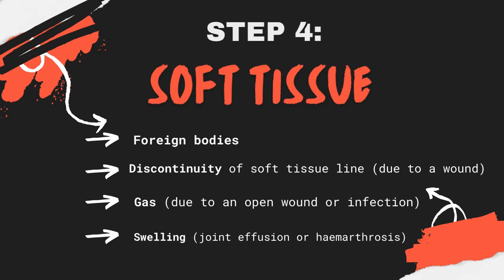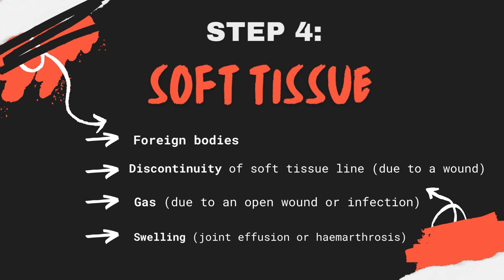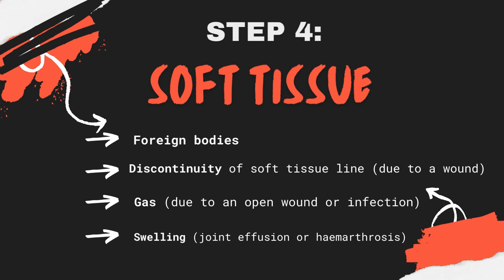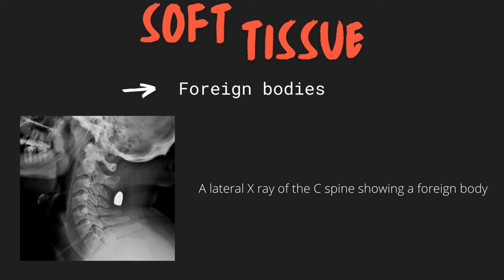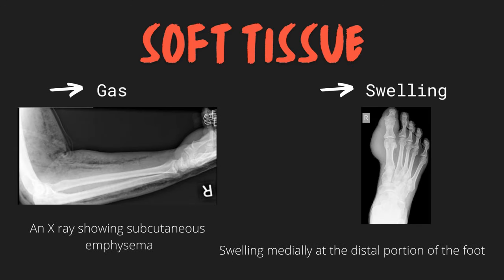The last step of the ABCS approach involves looking at the soft tissues. Abnormalities to look out for include the presence of foreign bodies, discontinuity of the skin surface or dressings which could imply a wound, gas which can be seen due to an open wound or infection, and swelling as a possible sign of infection, haemarthrosis, or joint effusion. An example of a foreign body is shown on a lateral x-ray of the C-spine, with a foreign body behind the C3 and C4 vertebrae. Another x-ray shows subcutaneous emphysema, and a further example shows soft tissue swelling occurring medially at the distal portion of the right foot.